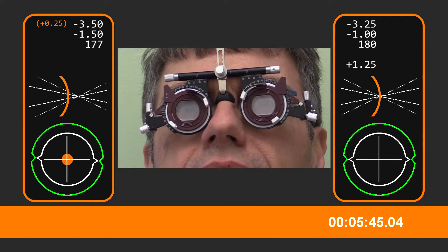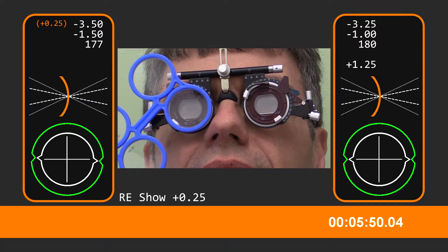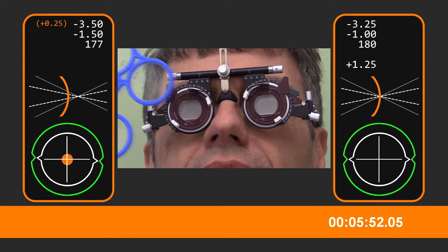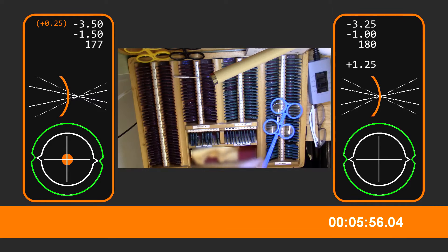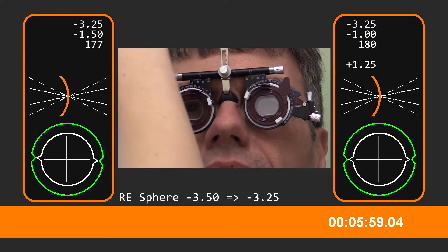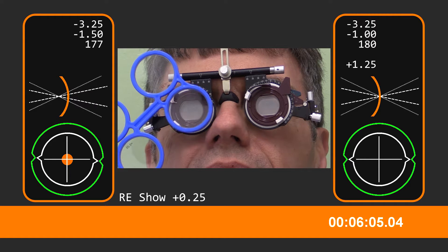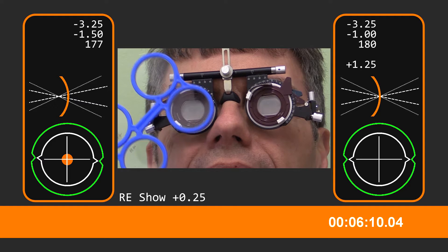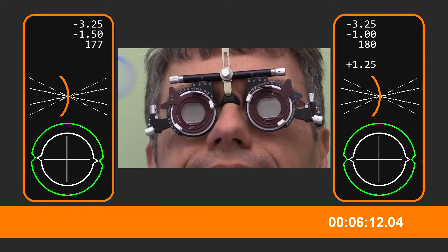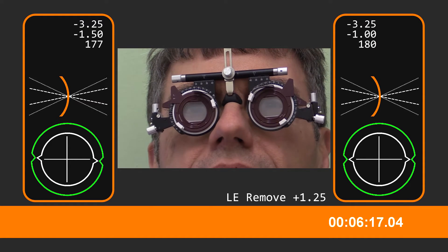Down in there. Take it out of that side. Again looking at the smallest that you can, is it any clearer with that lens? The same or without? Probably the same I reckon. About the same there. And with that lens the same or without? And again with. I'll pop that lens out there.